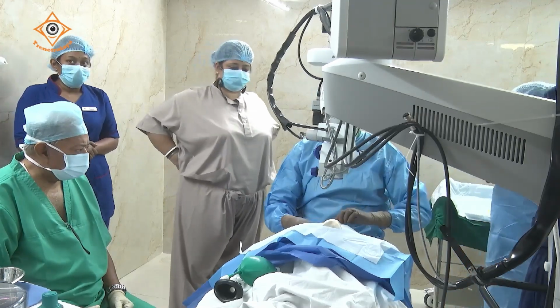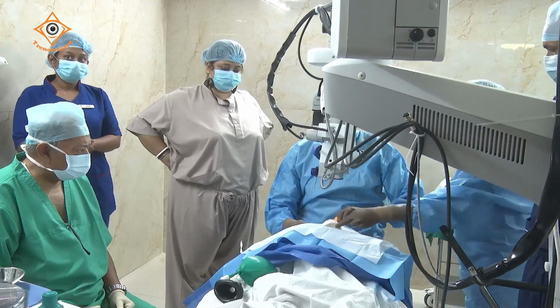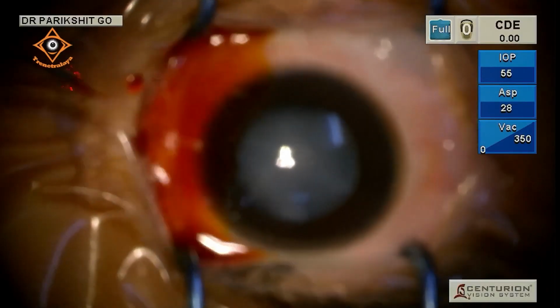Before you jump into the second eye, make sure what is the refraction. Did you get what you wanted or targeted? So that's a very good point. You brought it out.